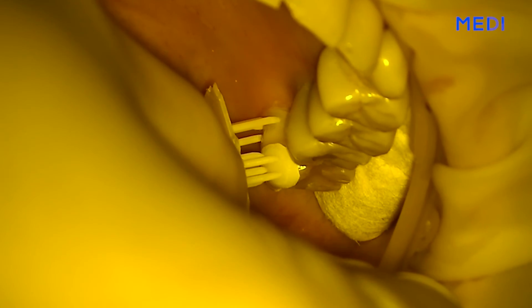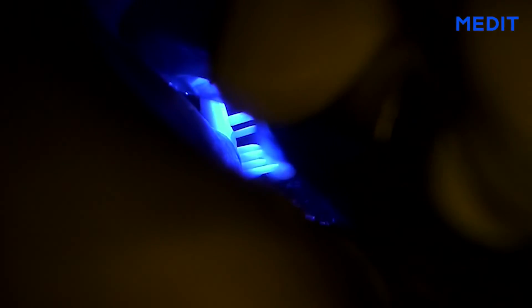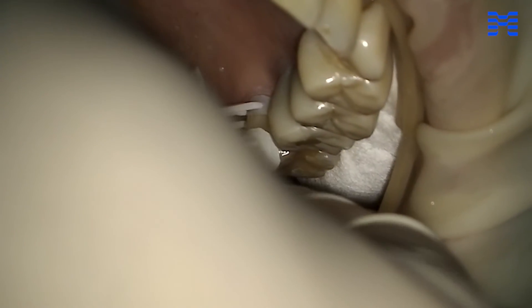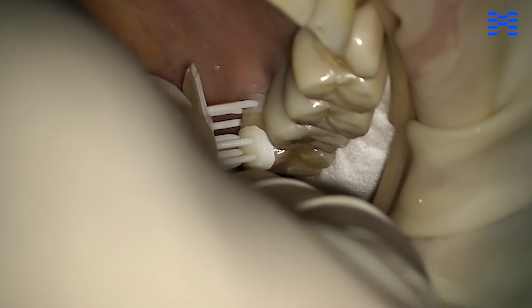For the last feature, let's look at the cervical inlay design. Medit ClinicCAD can make inlays for cervical abrasion treatment. In the software, this restoration type is referred to as cervical inlay.